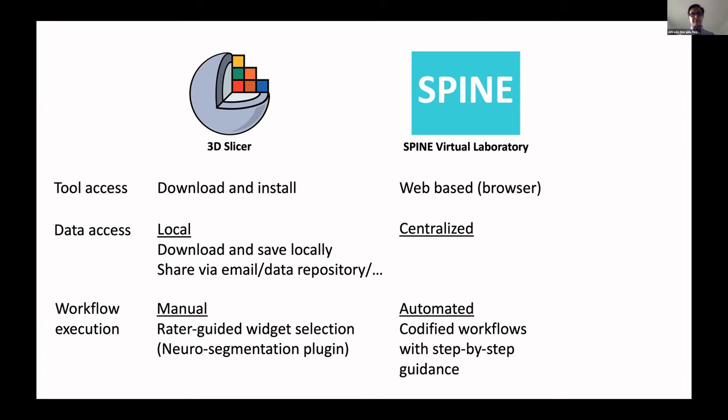It's those workflows that are codified, that are sent just as text to the contributors, are going to be moved to codified workflows, step-by-step guidance. And in every step, they will only have access to the tools that are required for every specific step. And this will come a little bit easier to see later.